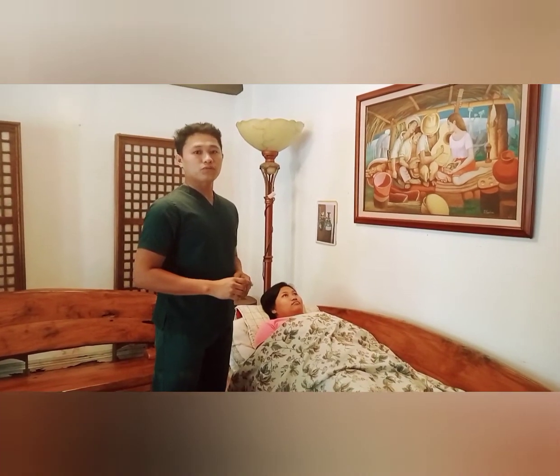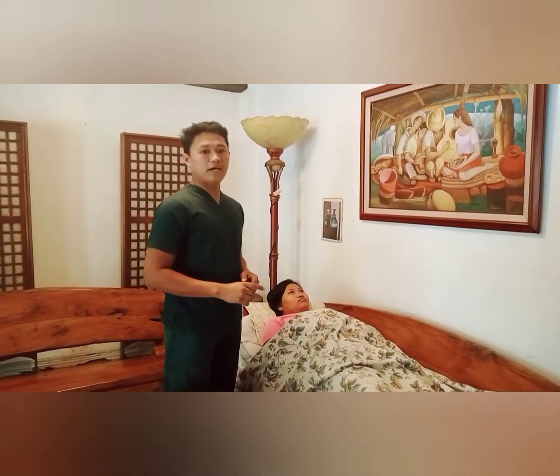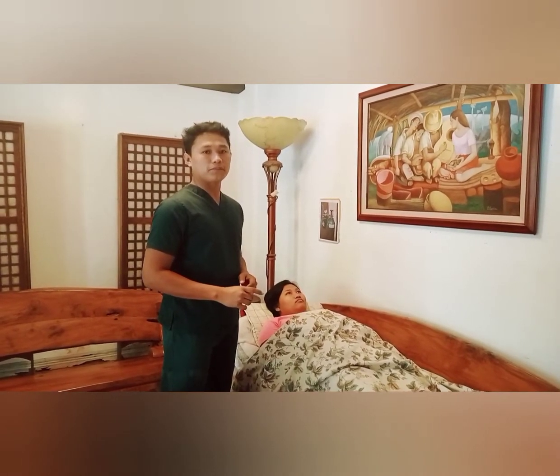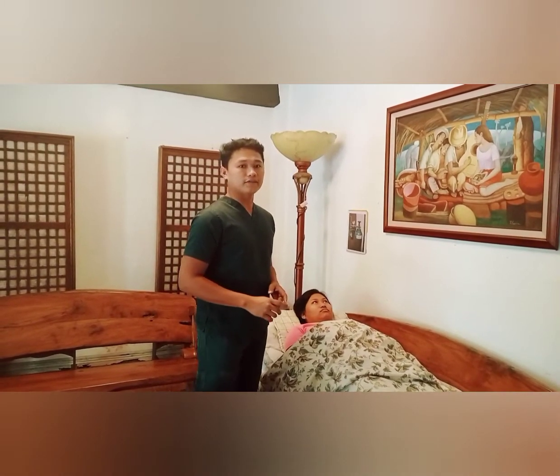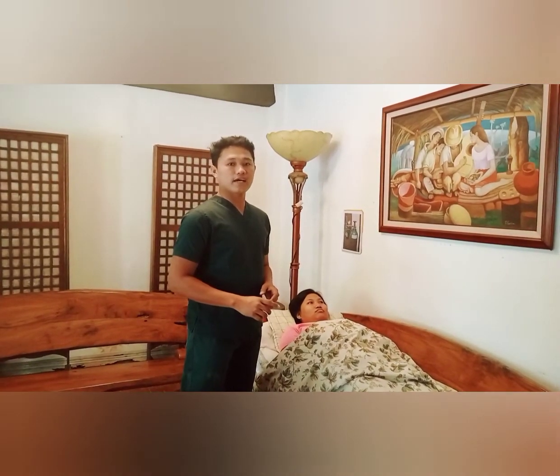First, before we proceed with the procedure, check the doctor's prescription. Next, perform hand hygiene and wear gloves, if available, to prevent the spread of infection and microorganisms. Next, explain the purpose and procedure to the client. Providing information promotes cooperation and allays his or her anxiety.